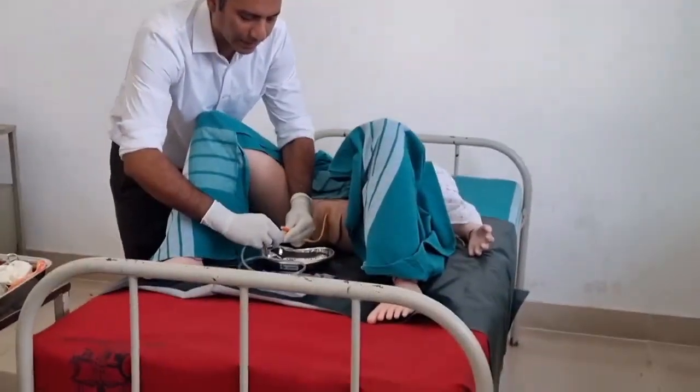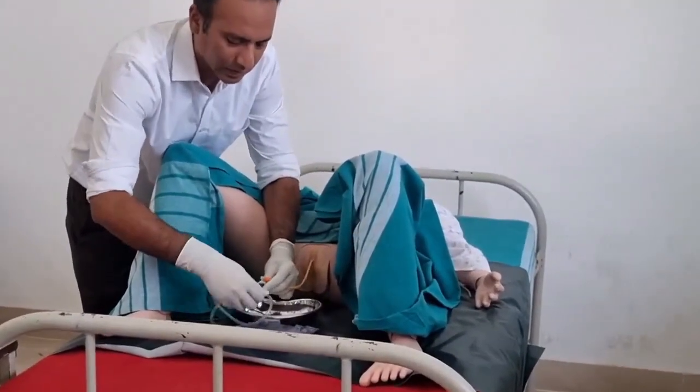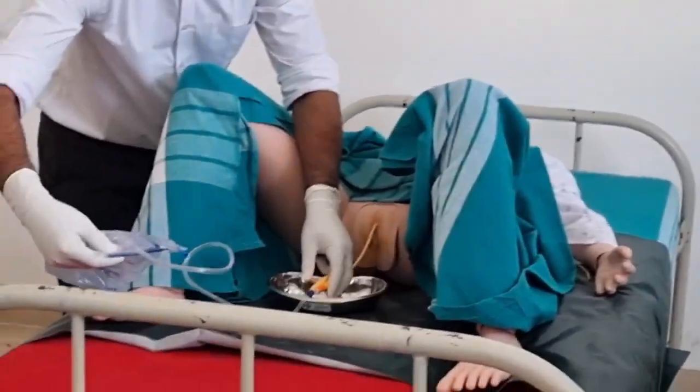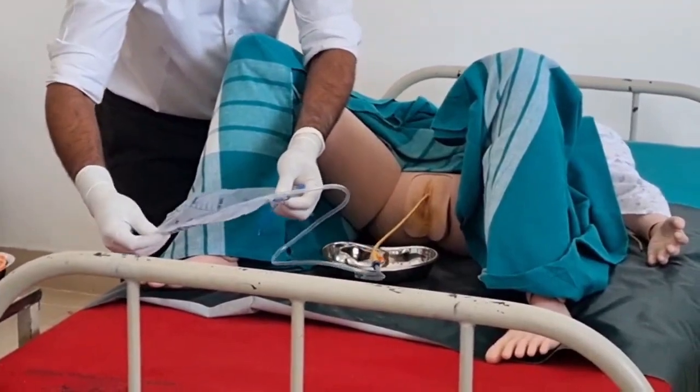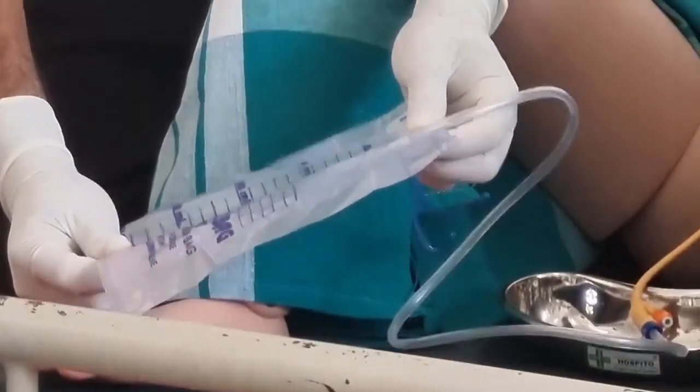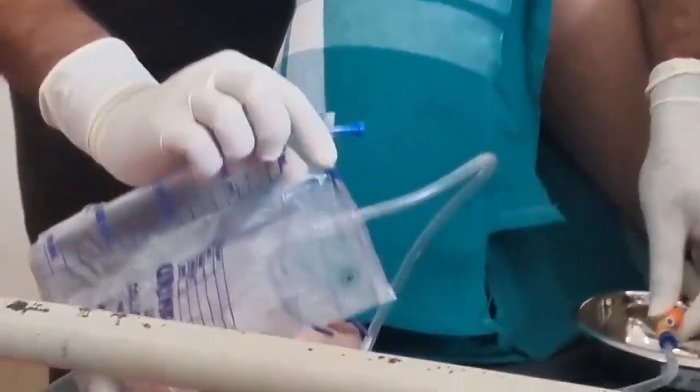So once the urine bag is connected here, it will start flowing into this bag. This urobag has a capacity of up to 2000 ml. That is, it can collect up to 2 liters of drained urine.